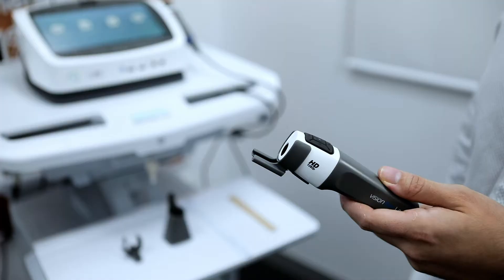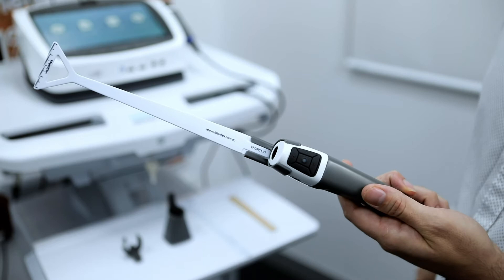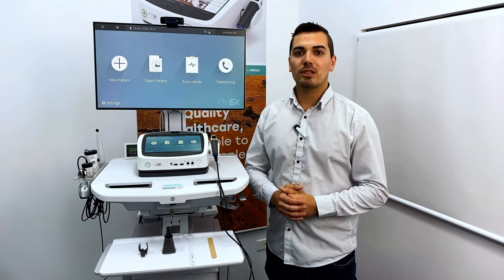The wound measurement stick is attached in much the same fashion. Remove the measurement stick from the packaging and slide it into the attachment until it reaches the marker. The advantage of the measurement stick is it allows you to take a consistent image from the same distance each time.